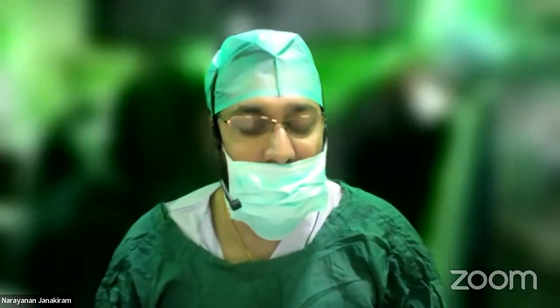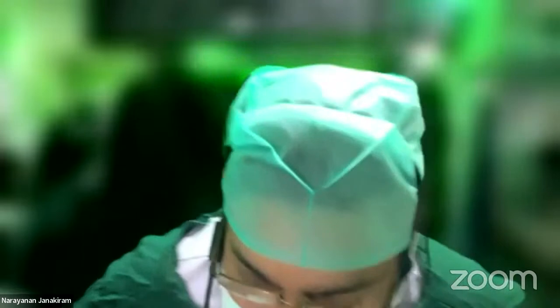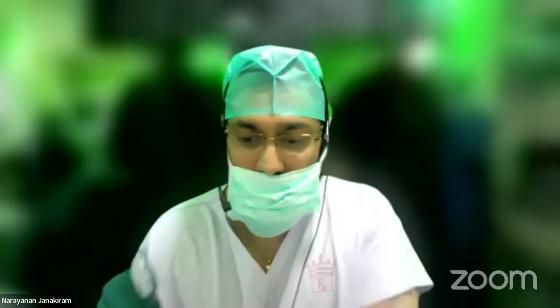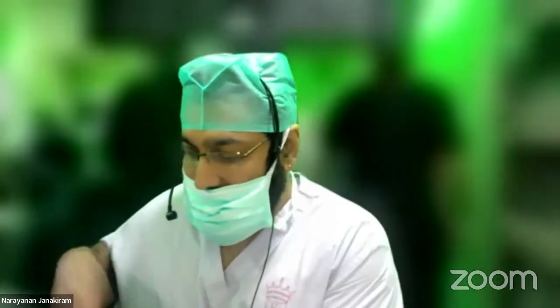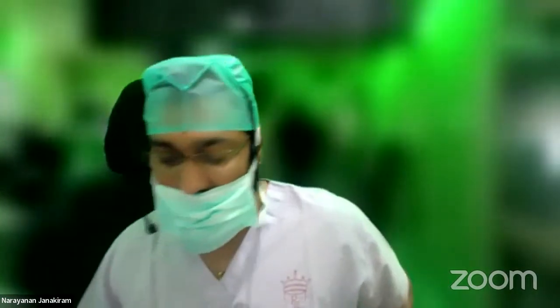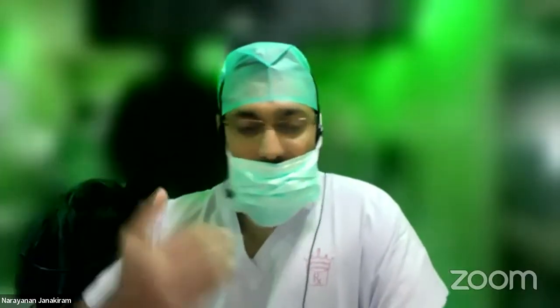I don't like it, because you see, number one, it takes time. Number two is that if it's so big like this, you have to bend the coblation wand. You saw it was going till the choana. You cannot do that with a straight coblation wand. So if you bend, it will get obstructed. The channel will get clogged very often. So if it's going right till the choana, coming inside the nose, then coblation adenoidectomy is not good.